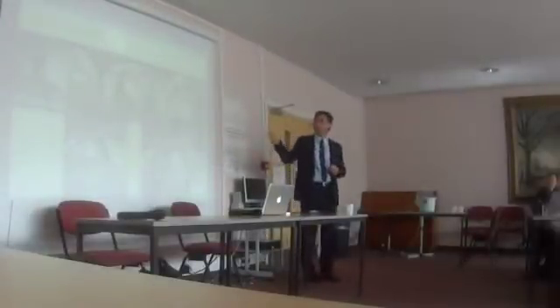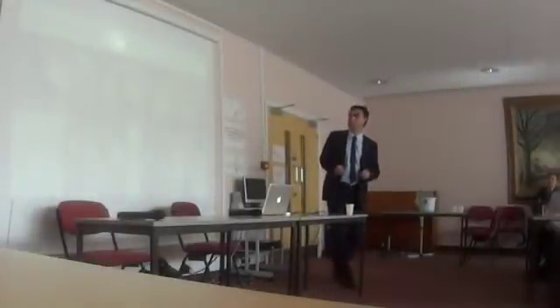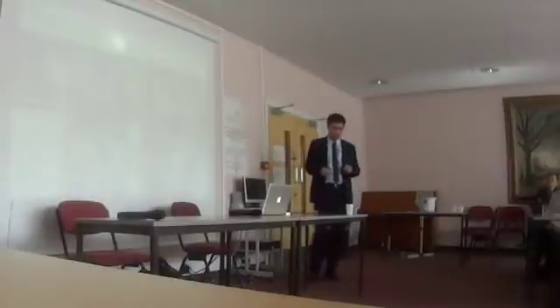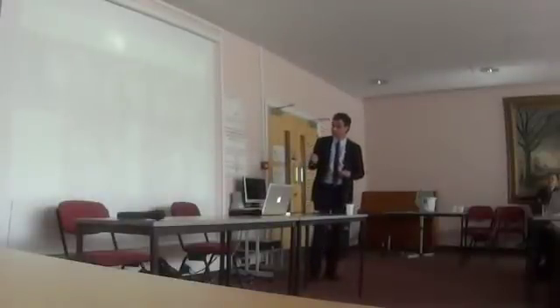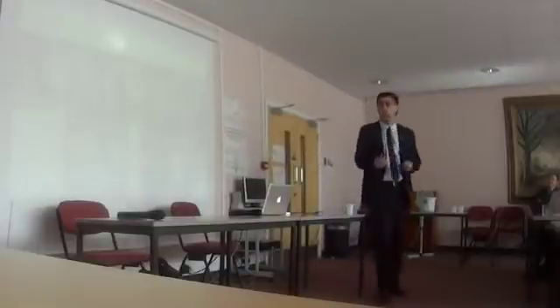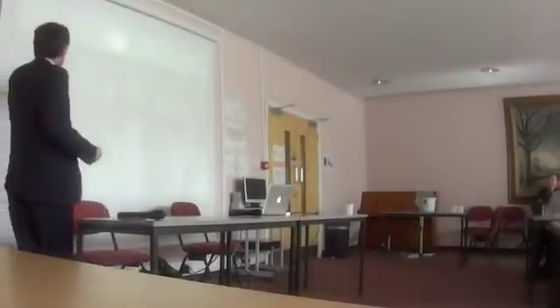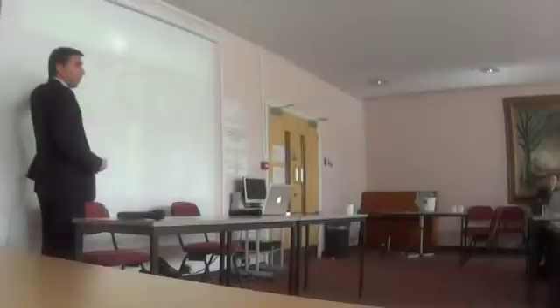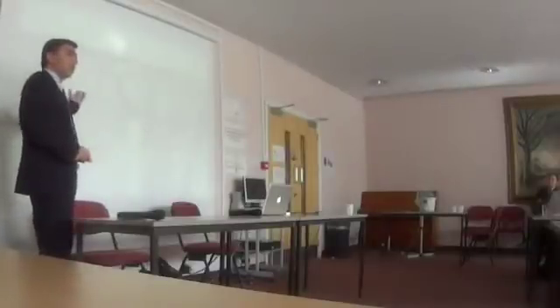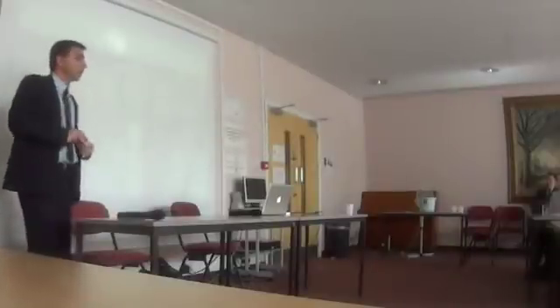So these are the pictures we saw briefly on the echocardiogram. I don't think it shows as well as I want, because of the brightness here. But basically it shows his left ventricle is dilated, it's baggy, and also that part of the muscle here is not contracting as well as the rest. This gives us a clue that this part is probably dead or not functioning as it should.